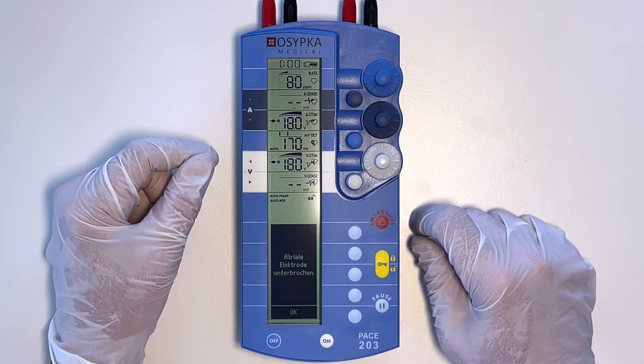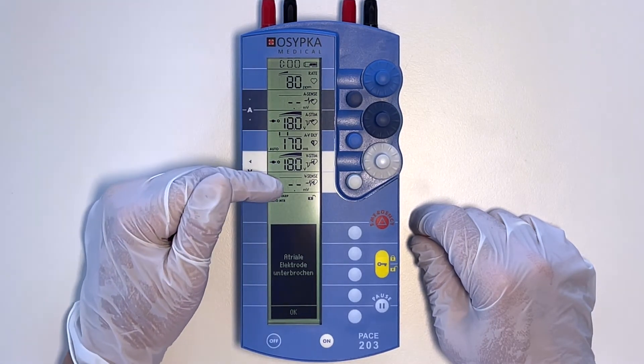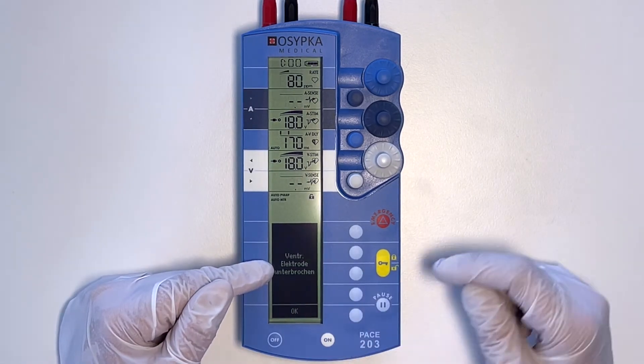The device will also check to see whether the leads are connected. You can see here the atrial lead and the ventricular lead is disconnected. Press OK to stop the tone.